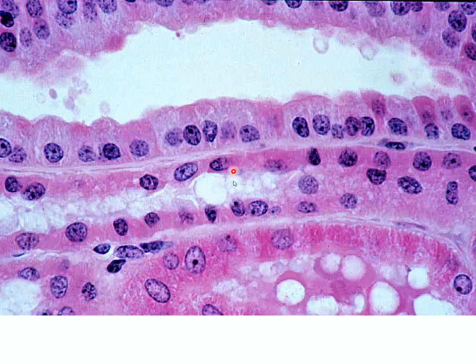Now, as we look at our other tubules, we're going to get an idea of their relationship. You notice we have tissue and cells that look very much like a proximal tubule, and here we can see a lot of nuclei, shorter cells. This looks very much like a distal convoluted tubule. So we got a collecting duct. So if we're in the medulla, this is going to be part of our loop of Henle. This is going to be our thick ascending limb, and this is going to be our thick descending limb because of their similarities to what we saw with distal convoluted tubule and proximal convoluted tubule.